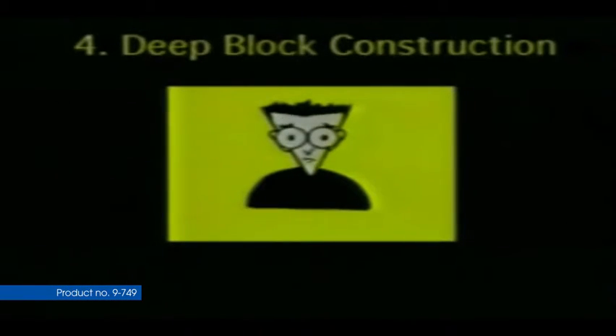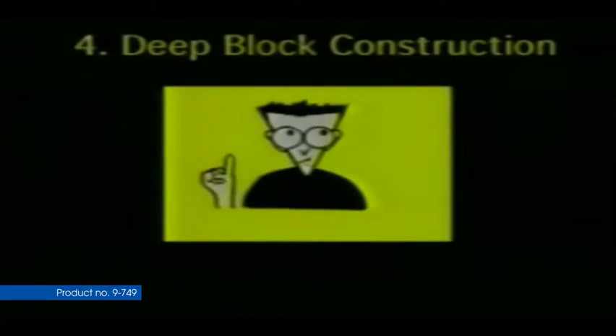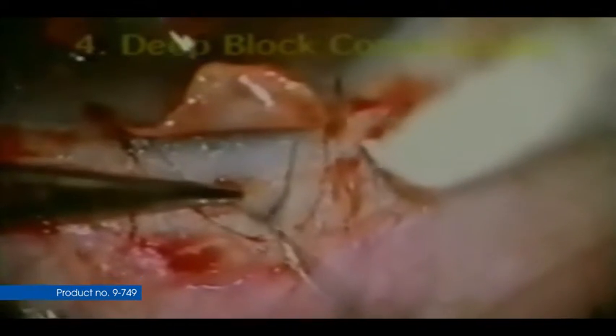Step 4: The deep block is where most surgeons have trouble, because they are not used to dissecting this part of the anatomy. Construct it at one half millimeter inside of the superficial flap. The cuts must be deep, down until the gray of the ciliary body shows. The tendency is to be too superficial, which will lead to difficulty in identifying Schlem's canal. Don't worry if you go through the sclera exposing the ciliary body. At the apex, cut right down to the ciliary body until you can actually see it. Then back up a few fibers and start the deep block dissection with the Greasehaber mini diamond blade. You should be able to see the blue-gray color of the ciliary body glistening through the thin scleral mesh.